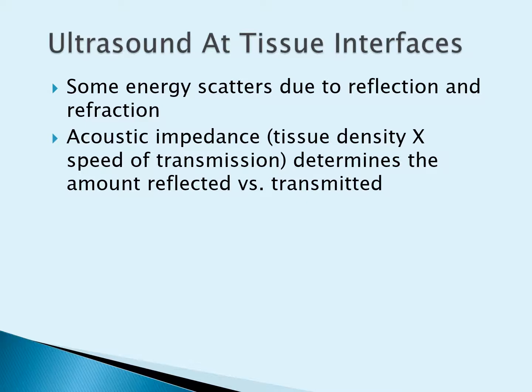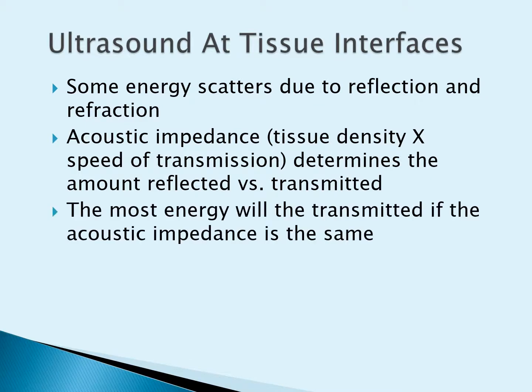You can think of this a lot like the Wi-Fi in your house. If your house is made of thin wafer board walls, your Wi-Fi is going to have a better signal in the other room than if it's transmitting through concrete walls. In a concrete wall, most of it's going to be reflected and is not going to penetrate the room that the Wi-Fi router is in.